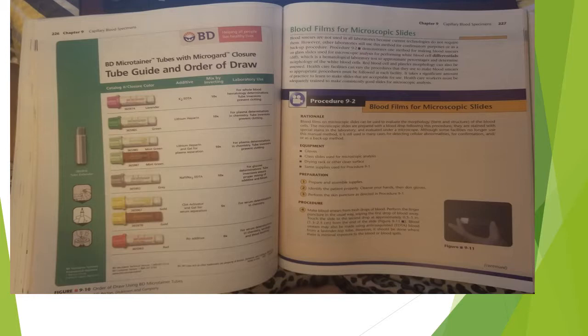Blood films for microscopic slides. Blood smears are not used in all laboratories because current technologies do not require them. However, other laboratories still use this method for confirmatory purposes or as a backup procedure.